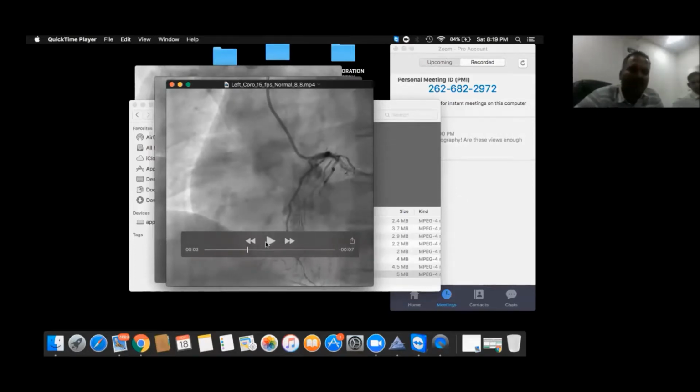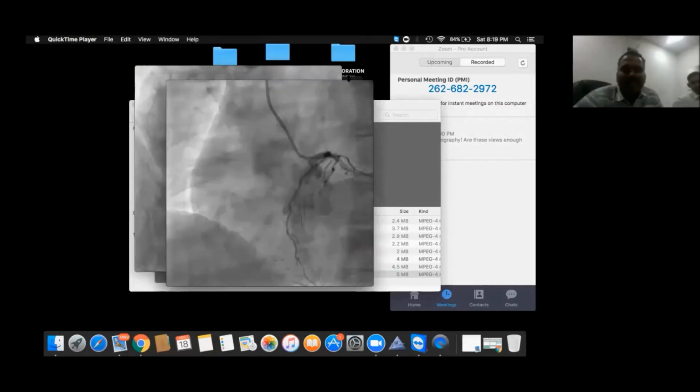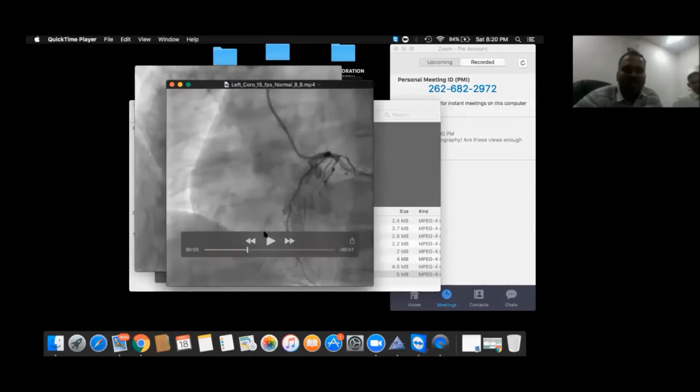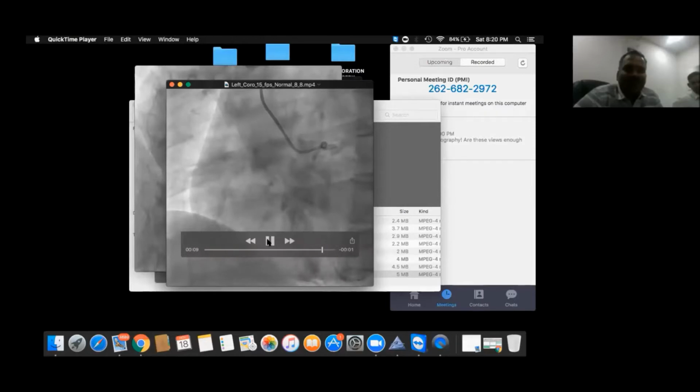Before that, what is your opinion? Do you think it's a short lesion or a long lesion? You felt it was a long lesion, right? Then I'll show that. So now you see it. Yes, sir. Still you feel it's a long lesion?